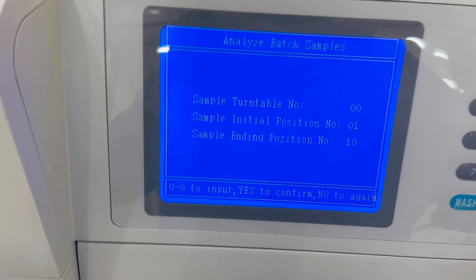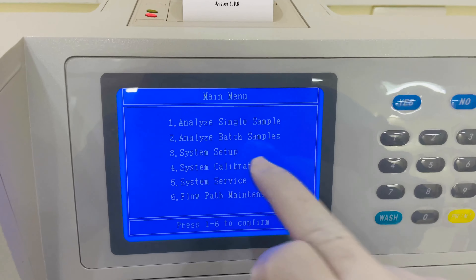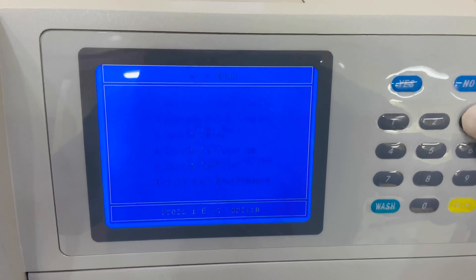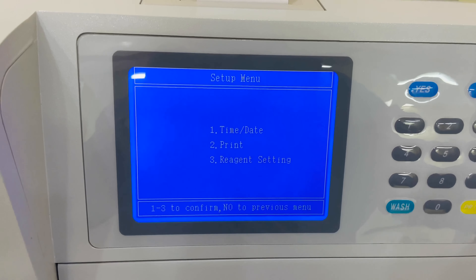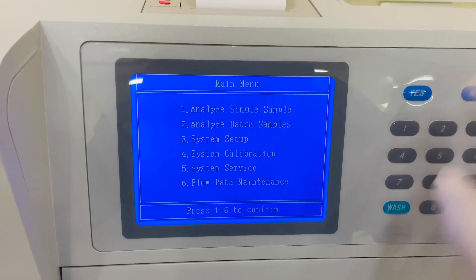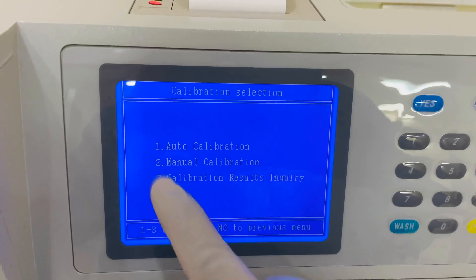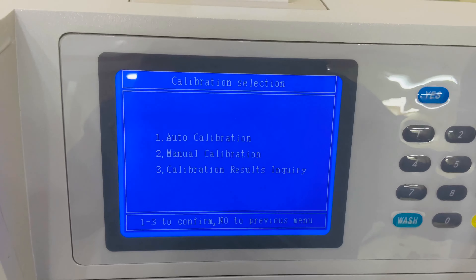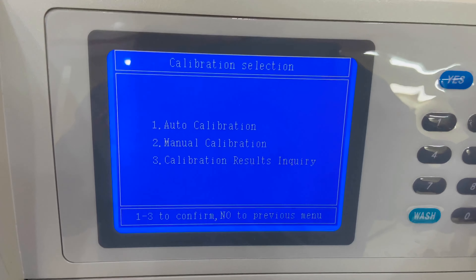You can see positions 1 through 6 and so on — up to 20 samples can run at the same time. QC 1 and QC 2 positions are used for the calibrator and controls. There is also a 'Flush' option used for cleaning purposes.